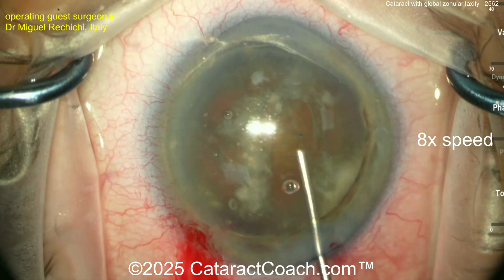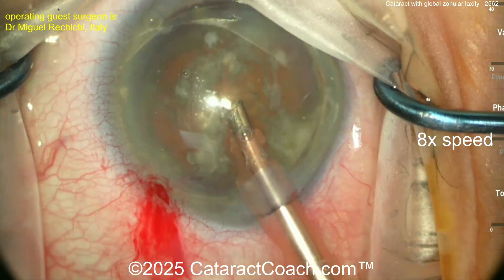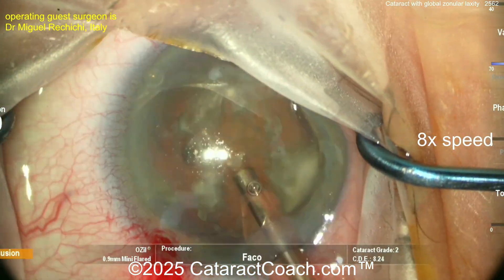He's got the entire nucleus in the anterior chamber now. Be careful of this, though — if you do it this way, you can put a lot more phacoenergy into the endothelium of the cornea. So be careful there.